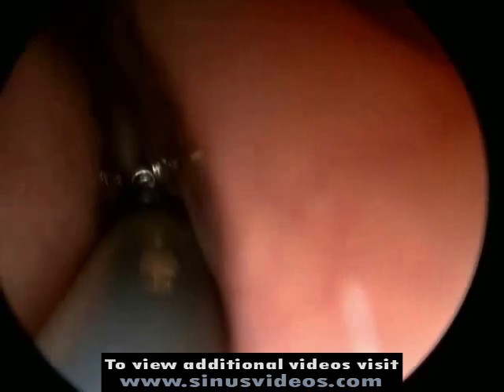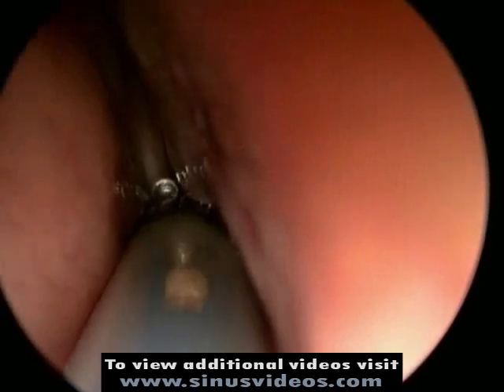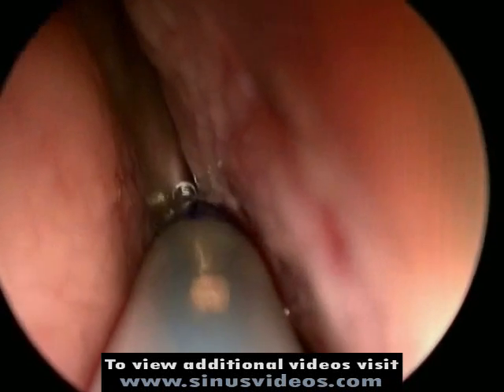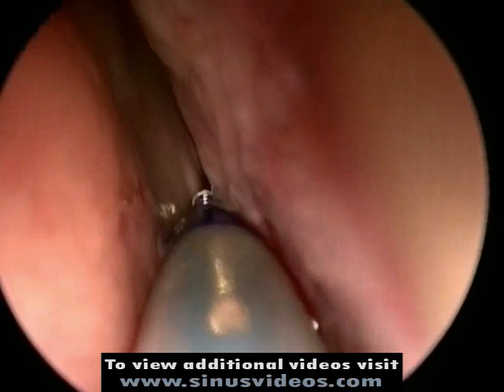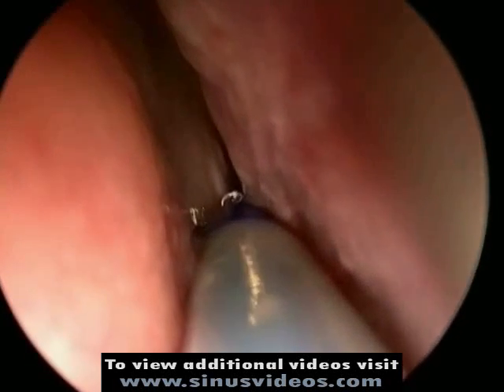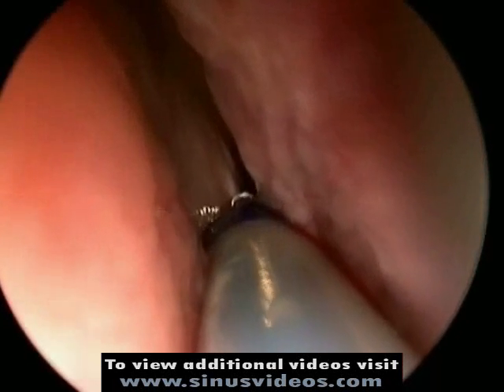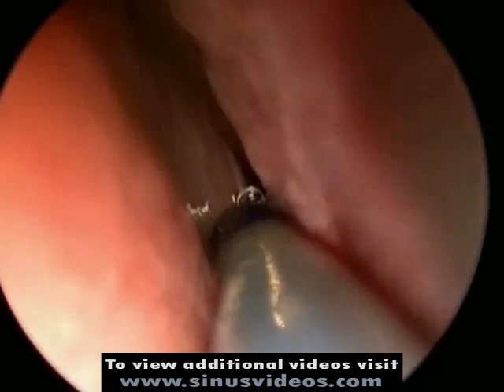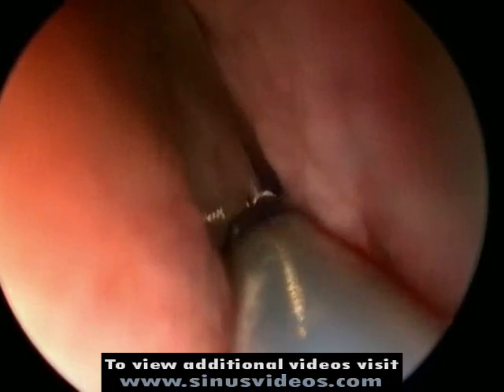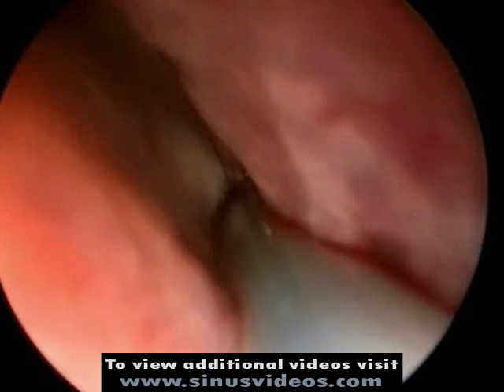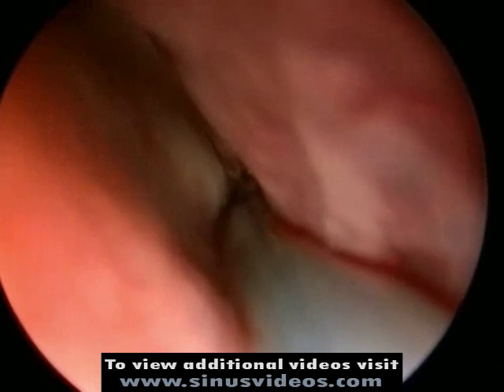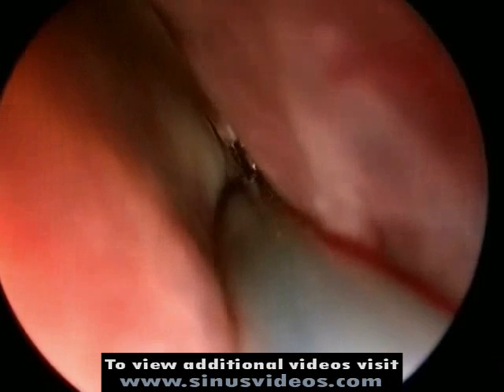This device is advanced into the sphenoethmoid recess and the illuminated guide wire is advanced into the region of the sphenoid ostium.